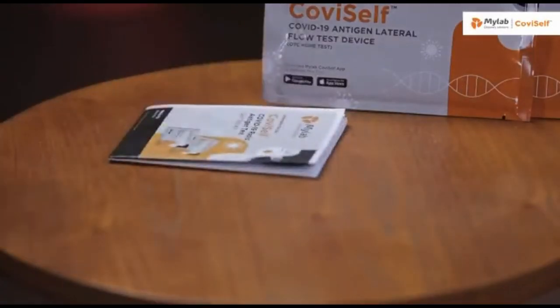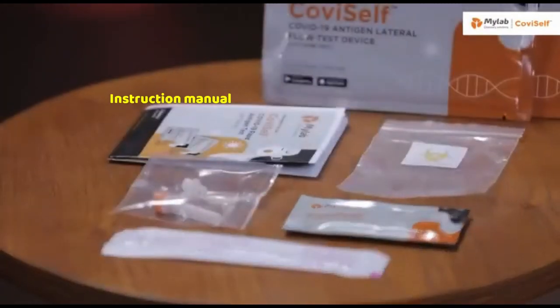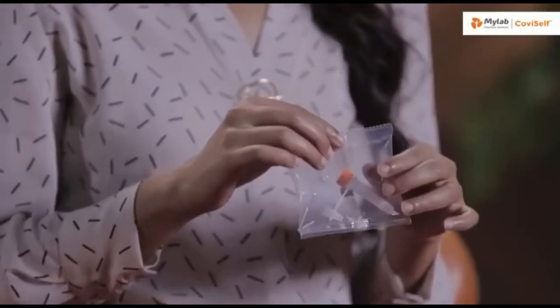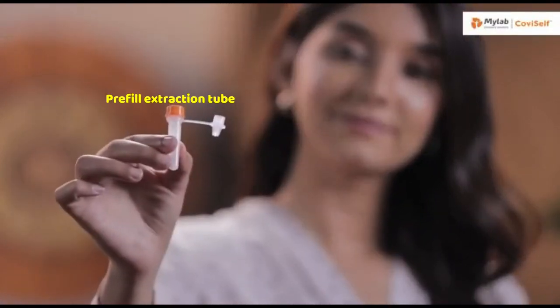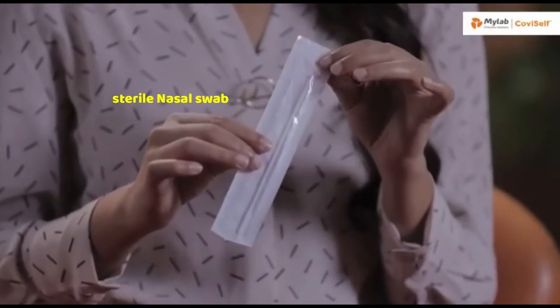Lay the contents of the kit on a table and I will walk you through them one by one. This is the instruction manual. This is a pre-filled extraction tube. This is a sterile nasal swab.